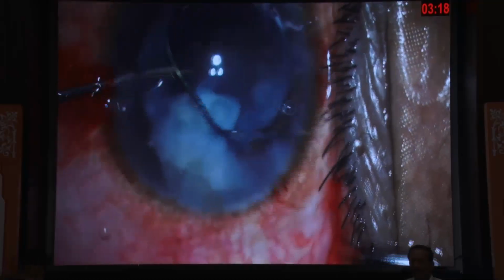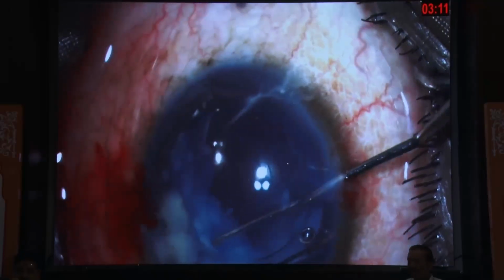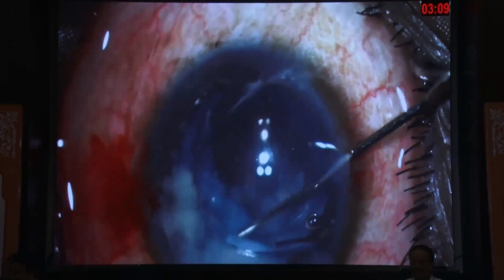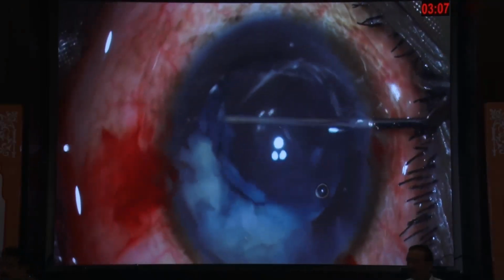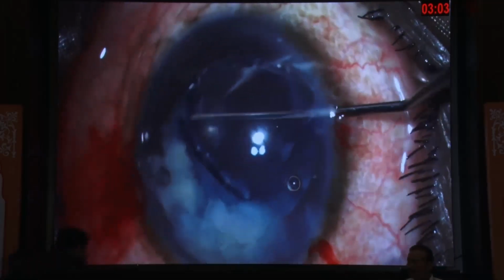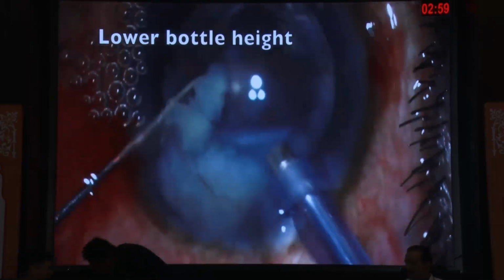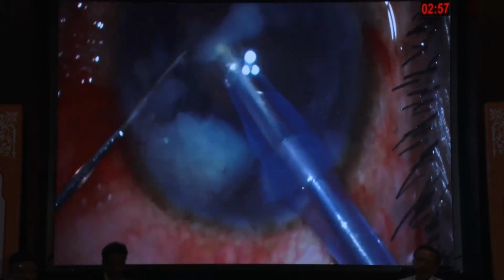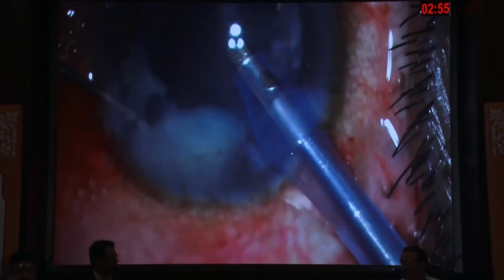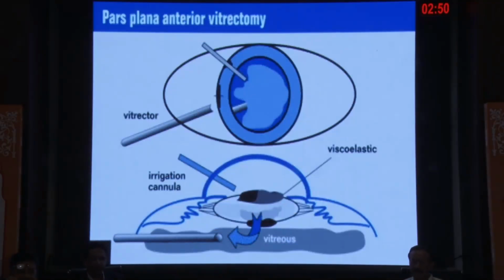Basically, what happens is you're putting the IOL either in the sulcus or above the iris, making sure the nucleus piece doesn't go back inside, because once it goes, then it is a VR surgeon's perspective, isn't it? So as long as you can act as a scaffold, make sure you maneuver these nucleus pieces. Here again, reduce the bottle height, because sometimes if you go with the full bottle height, the entire lens can also sink in because of overfilling the anterior chamber. So reduce everything, again slow motion phaco, remove the nucleus piece, but you see the lens was decentered.